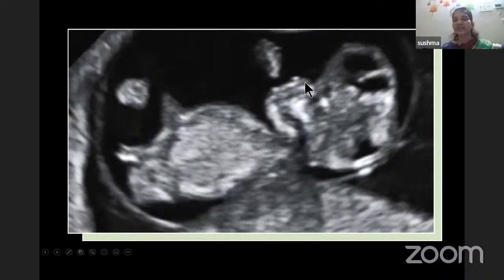So what we can see here is a mid-sagittal section of the fetus, not a perfect mid-sagittal section, but a sagittal section. Here we can see that in the sagittal section, this part of the brain is protruding out. It is not the normal shape that we are supposed to see, but this part here is protruding out, and this is because of the absence of the cranial vault. As you know, anencephaly is a second trimester finding, whereas in the first trimester, we only have acrania.